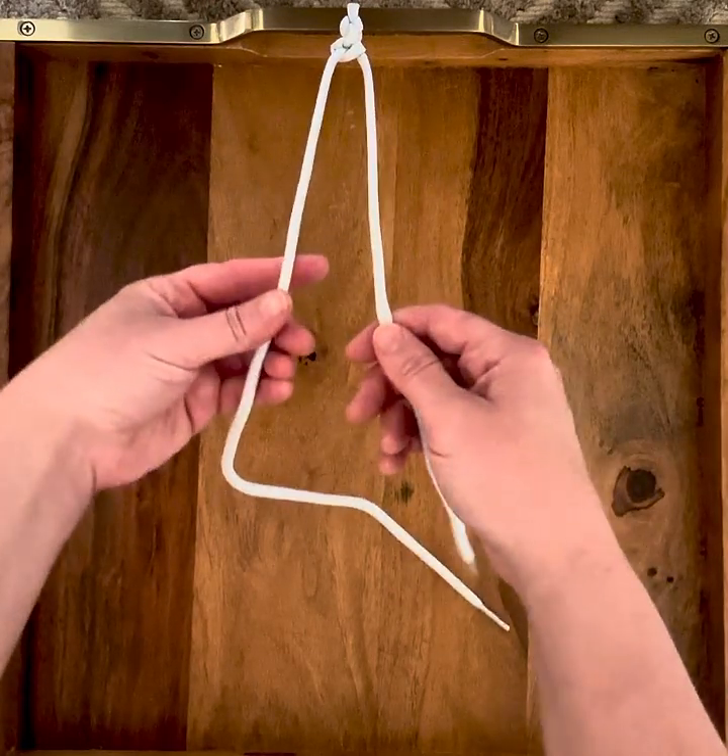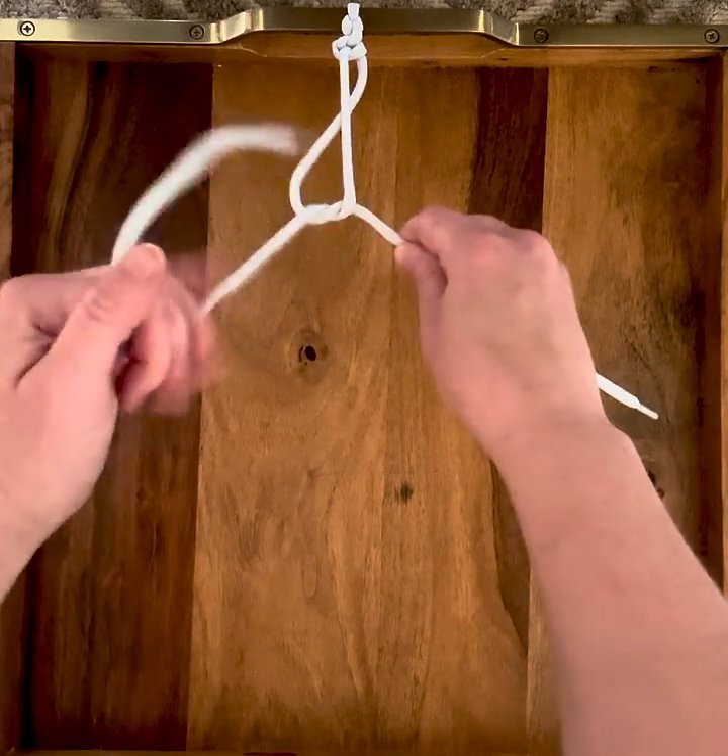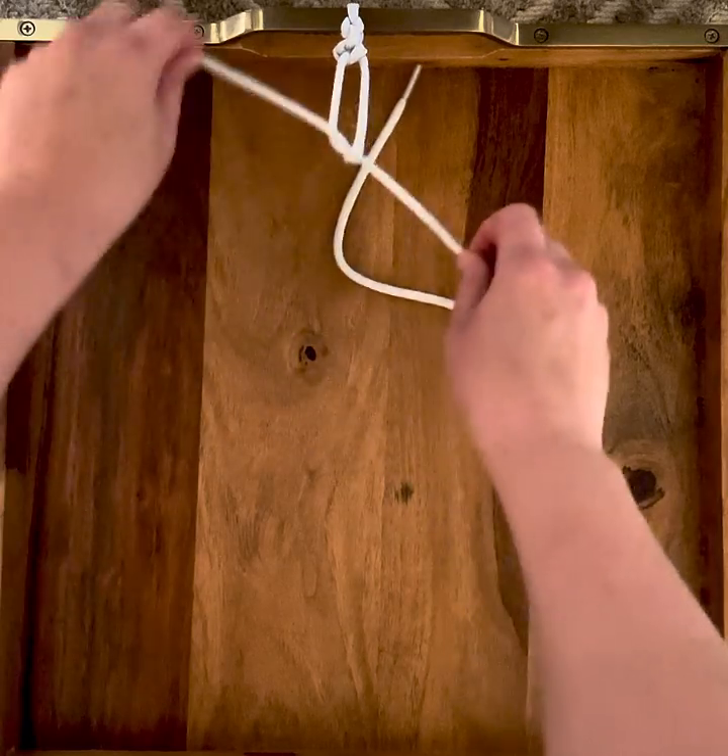Again: forward, around, underneath, pull through, set your knot.